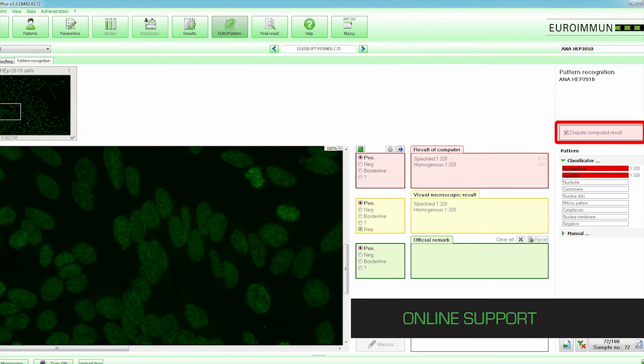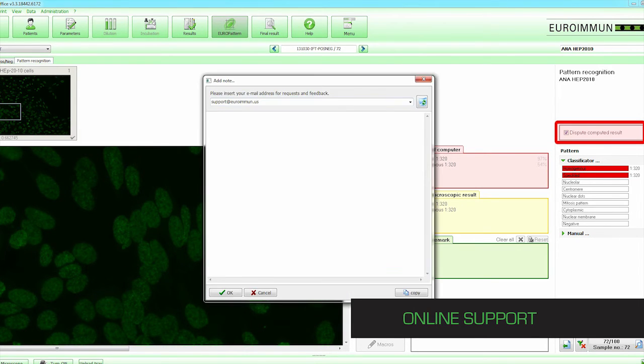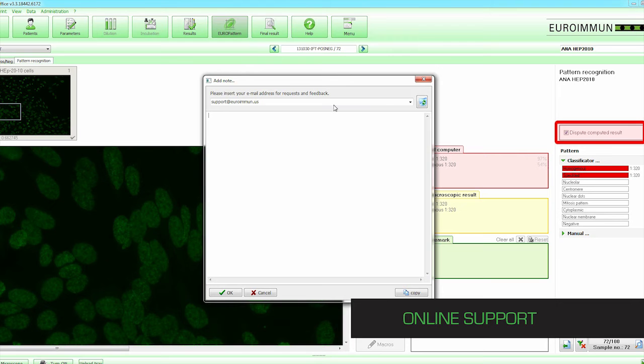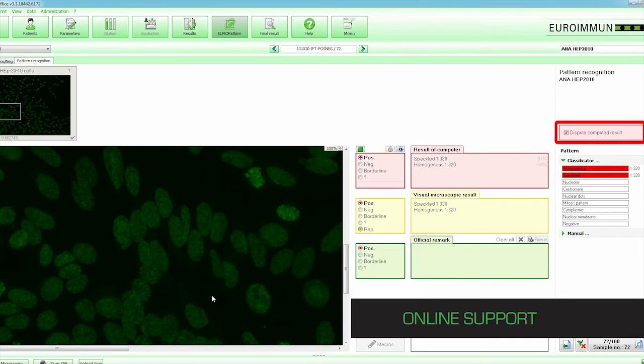With the click of a button, a window will pop up requesting an email address and a brief description of the issue. Once submitted, the result is sent instantly to Euroimmune ANA experts, who will correspond directly with the technologist.